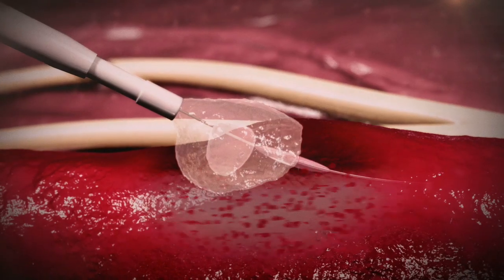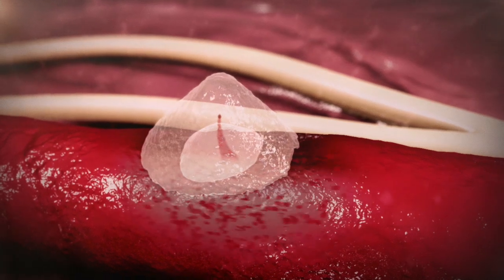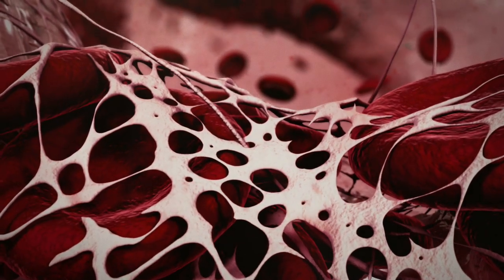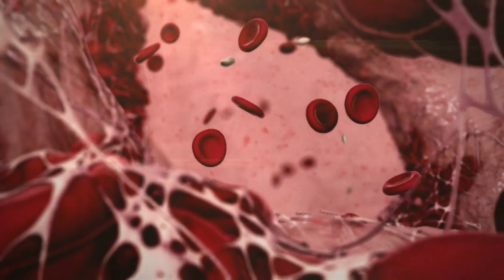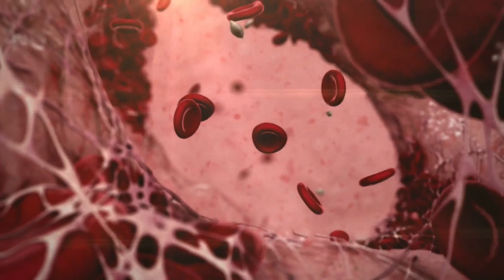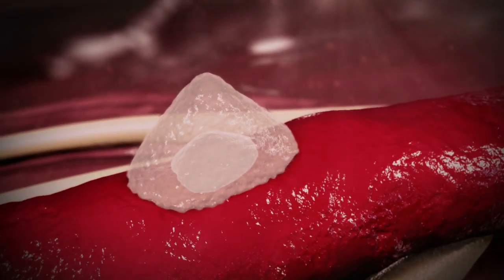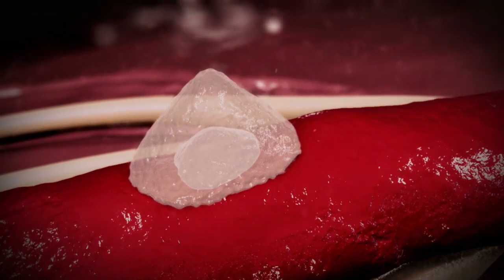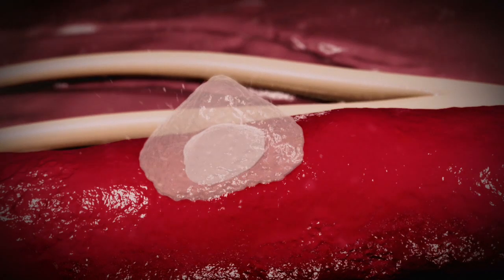After the balloon is deflated and the device is removed, the sealant instantly absorbs blood and fluids. Platelets and blood cells continue to collect inside the sealant's porous matrix, causing the sealant to swell three to four times its original size. The dual-action sealant produces a durable hemostasis and a platform for natural vessel healing.